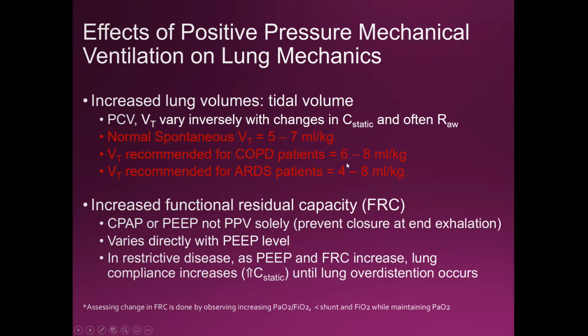For our COPDers, we maintain 6 to 8, and our ARDS is 4 to 6. That's Pilbeam. Egan says for tidal volume here, it's 5 to 7, COPD 6 to 8, and ARDS is 4 to 8. So if we were taking an exam, stick with these numbers. Okay.